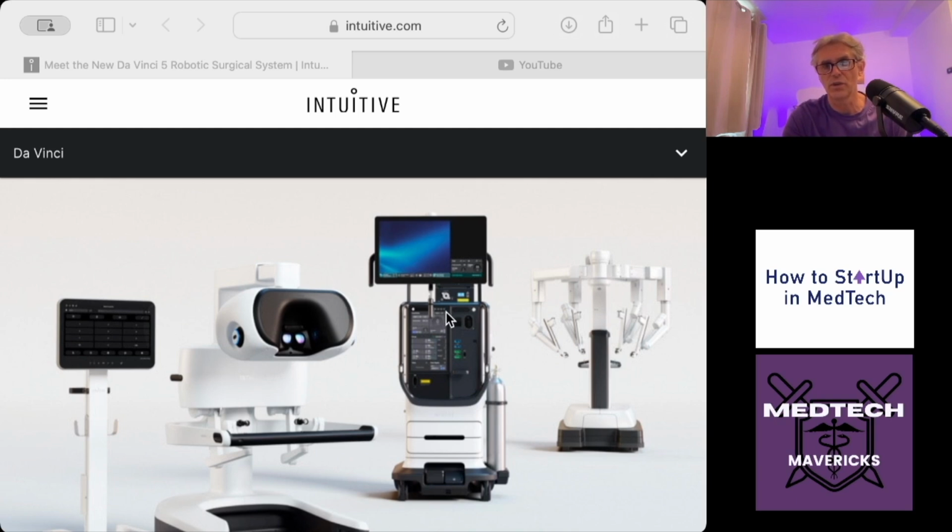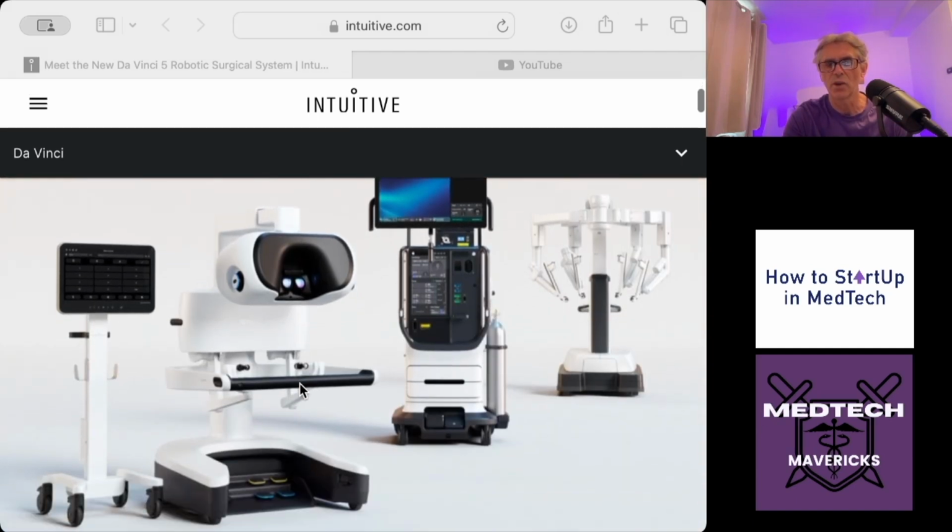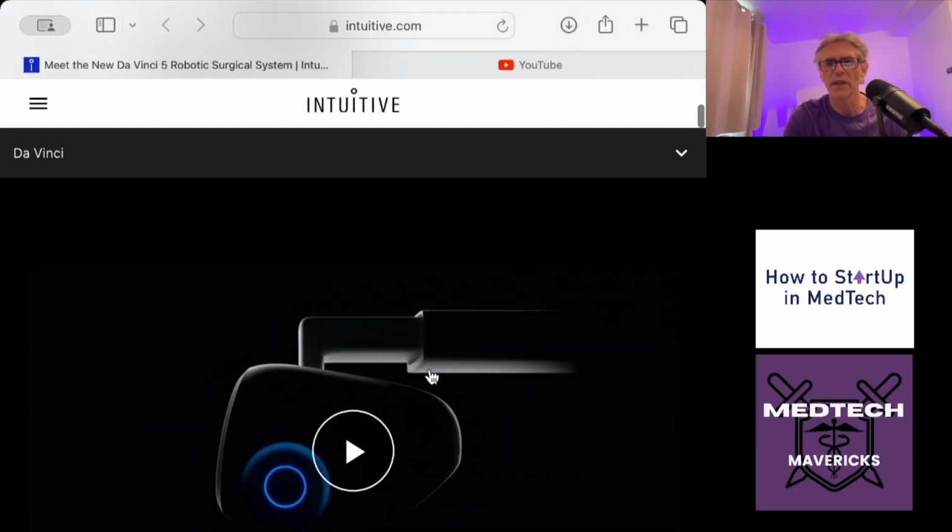It all talks to each other, and menus you can replicate here, inside here. You can replicate menus up here. You can replicate menus on the hub. And the whole thing is just really well connected. So when they say it's our integrated robotic, that's really what it is. So hopefully that's a little bit of a first overview that I'll give you there.